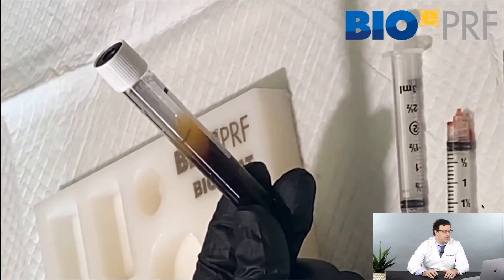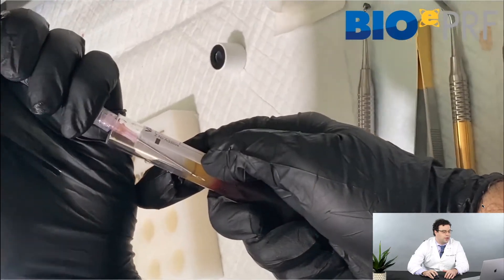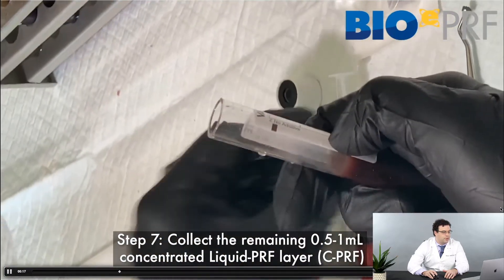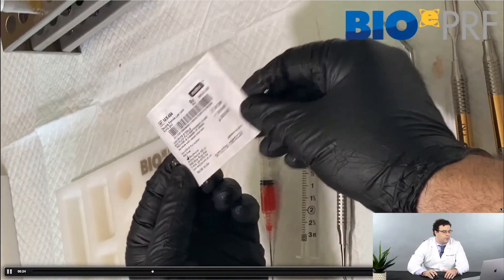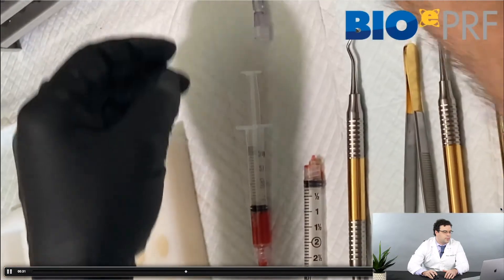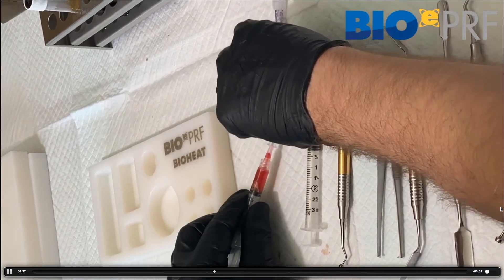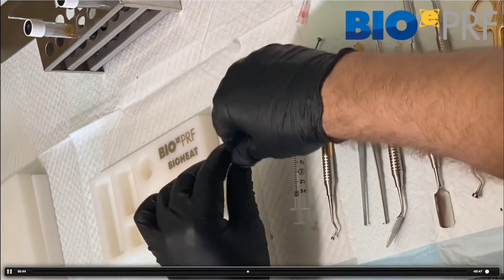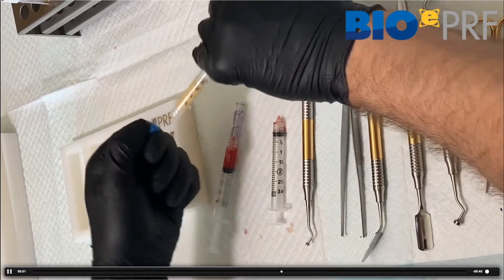Now with the remaining tubes, the top 2 mL has been removed, so we pop the lids and take the rich CPRF layer. We draw up the liquid as much as we can to the buffy coat layer — about one cc — and that's where most of the cells and growth factors are. Then we take the female-to-female luer lock, remove the needle, and prepare to mix the albumin gel with the liquid PRF.